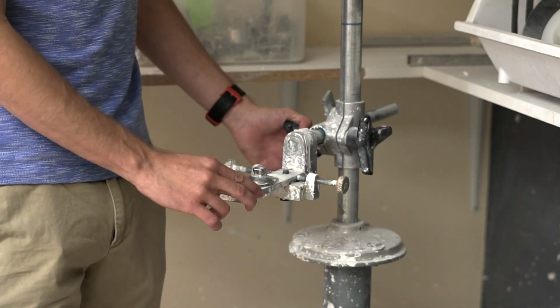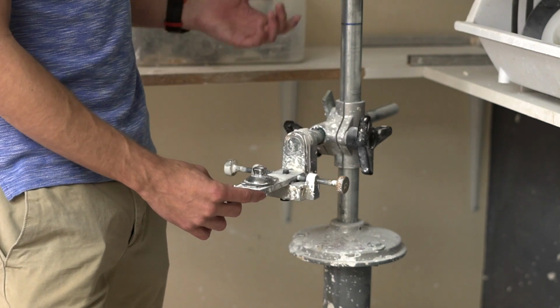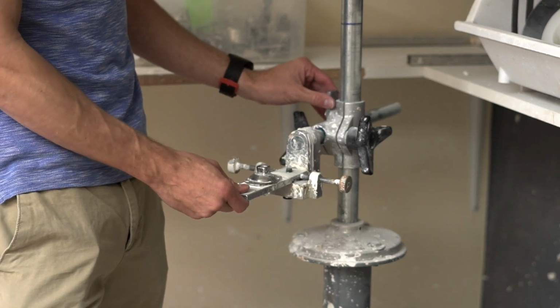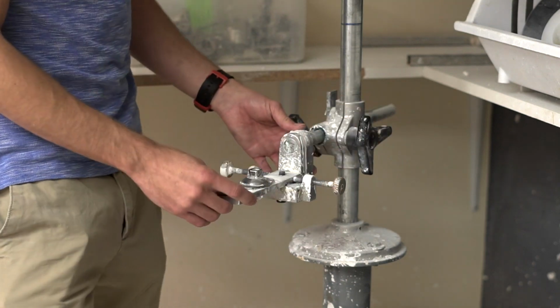Alright, so lastly we have the foot plate. We have gross adjustments with the foot plate, just like we do the crown. We have this knob here, which allows you to bring the foot forward and back. Also, we have this knob, which adjusts the height.